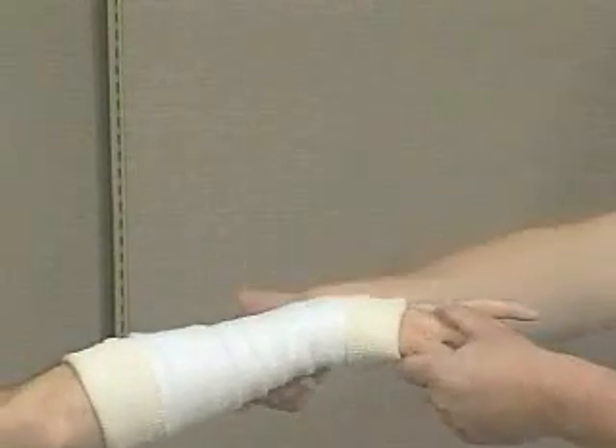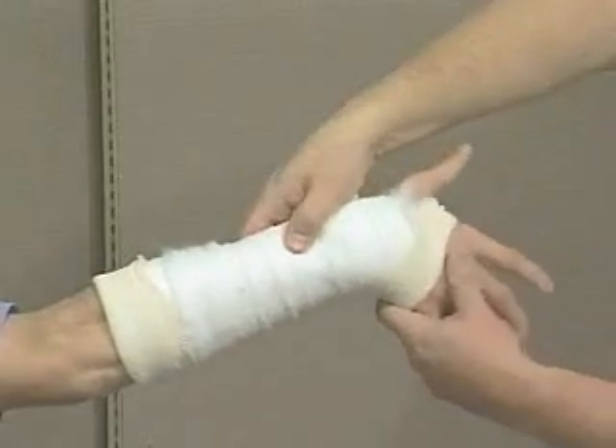Position the wrist in 15 degrees of flexion and 20 degrees of ulnar deviation.